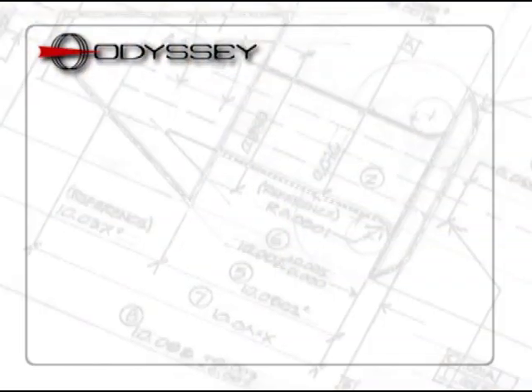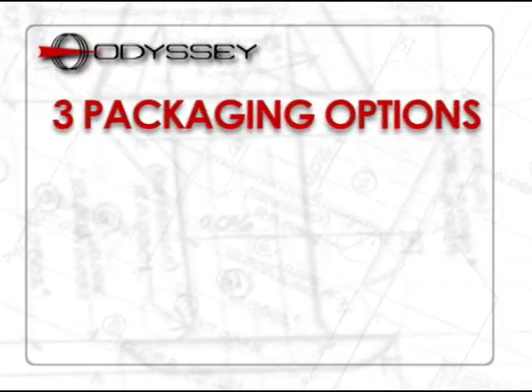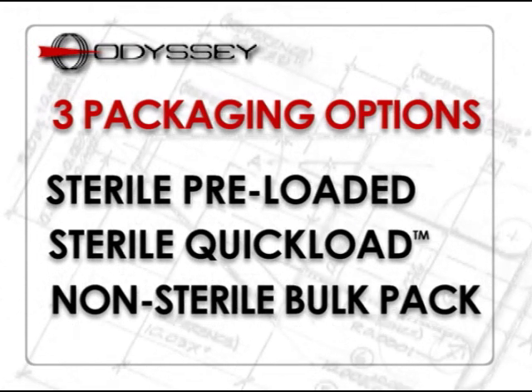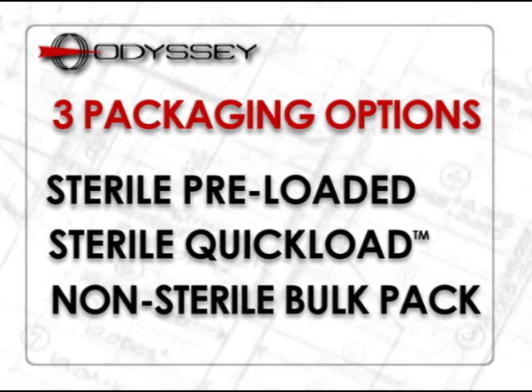like an umbrella in the wind. Parasol punctal occluders are available in three convenient packaging options: sterile pre-loaded, sterile quick load, and non-sterile bulk pack.